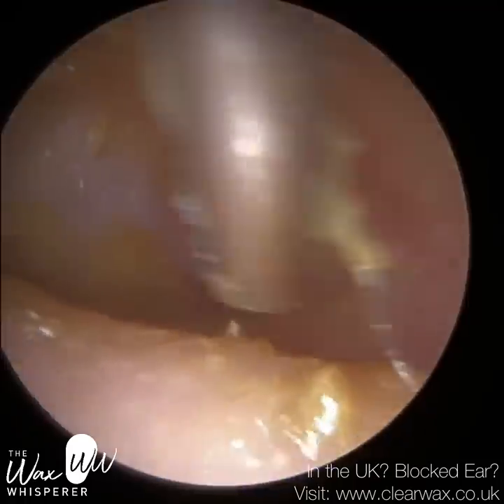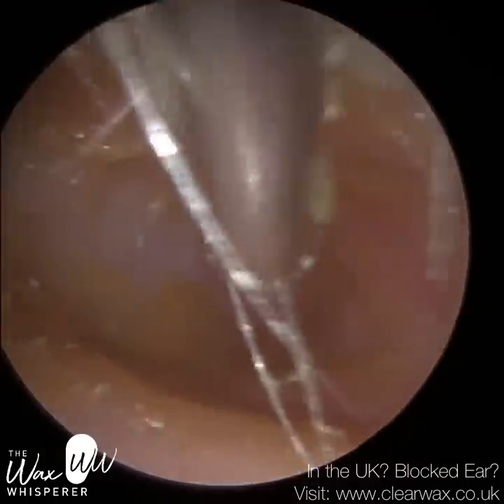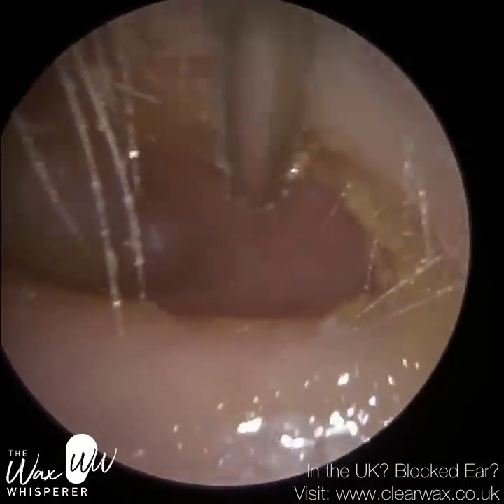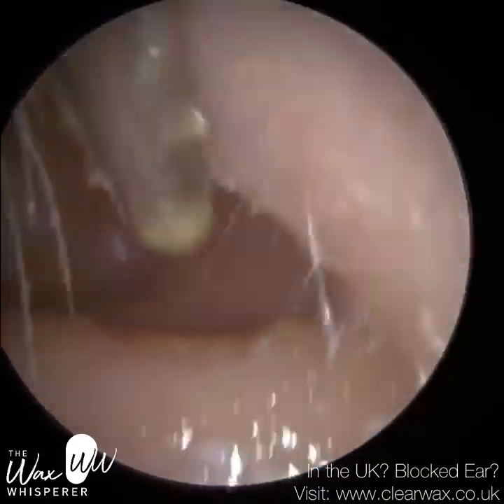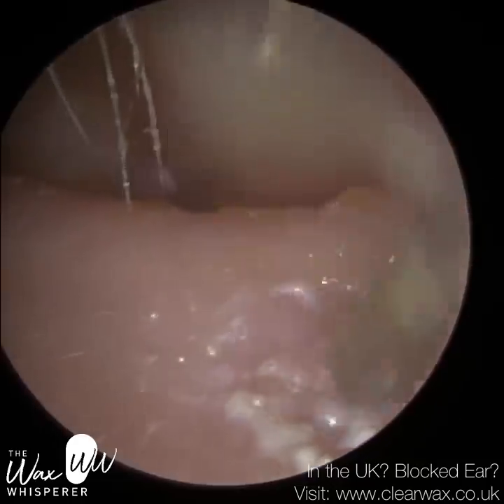I've got a client at the moment where you can actually see, once we remove the earwax, they haven't got a complete false fundus, but you can see it's developing. And they also had a canal cholesteatoma. I'm pretty sure I've uploaded this video. If I can find it, I shall put the video number into the description box.